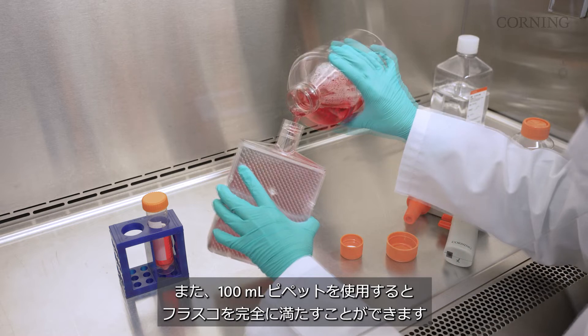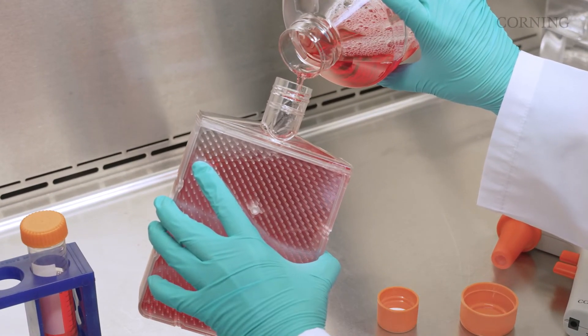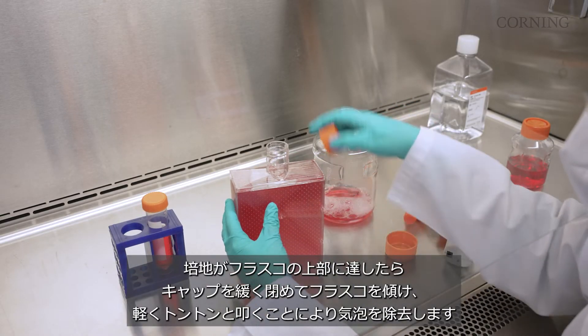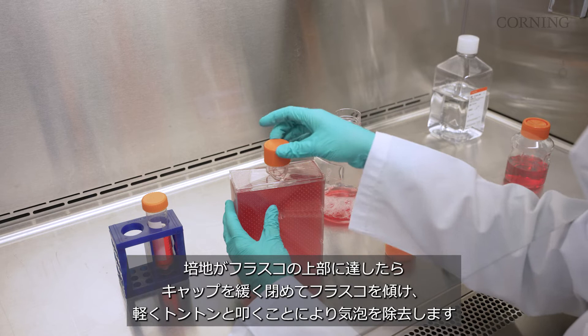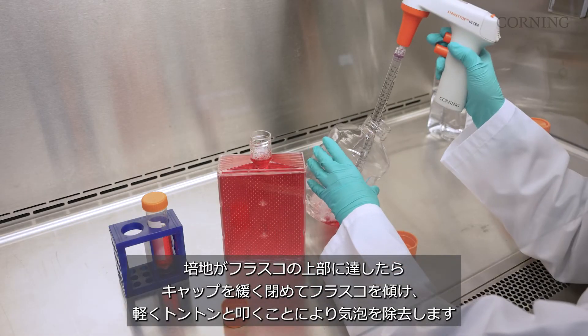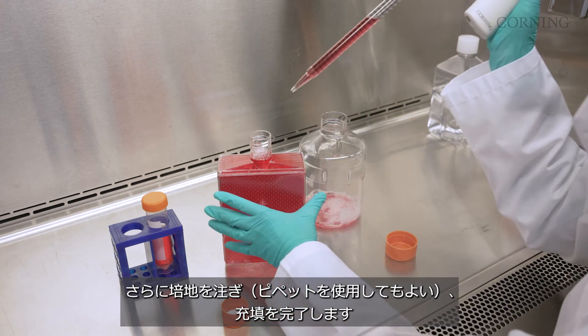You could also fill the entire vessel by using a 100 milliliter pipette. Once the media level reaches the top of the flaskettes, loosely replace the cap, tilt the flask, and tap it against the surface to release any trapped bubbles. Complete filling the vessel by pouring or preferably pipetting.